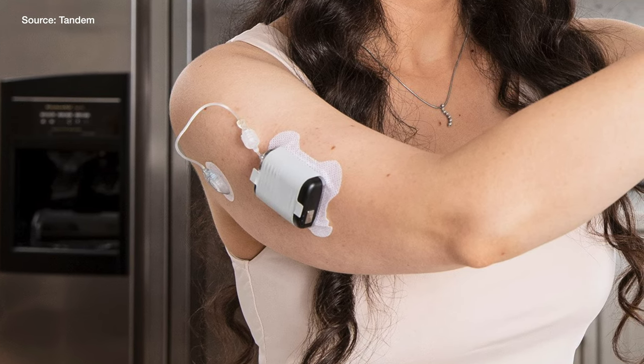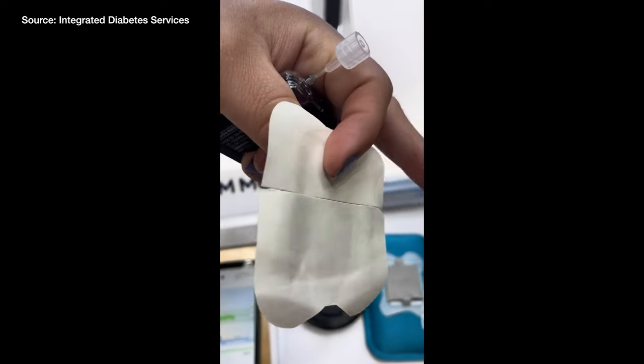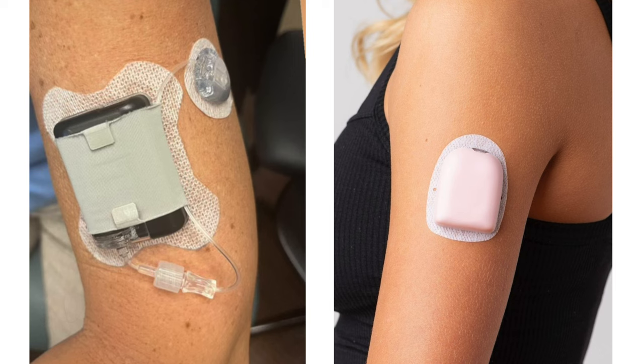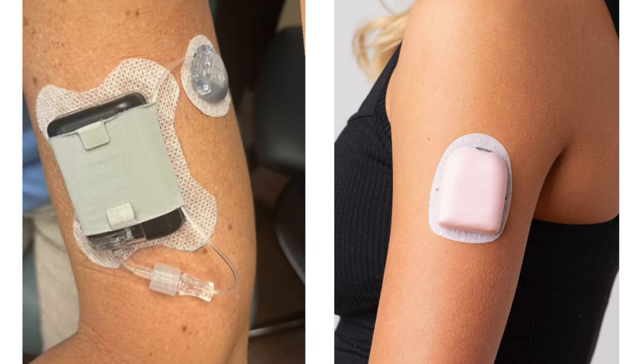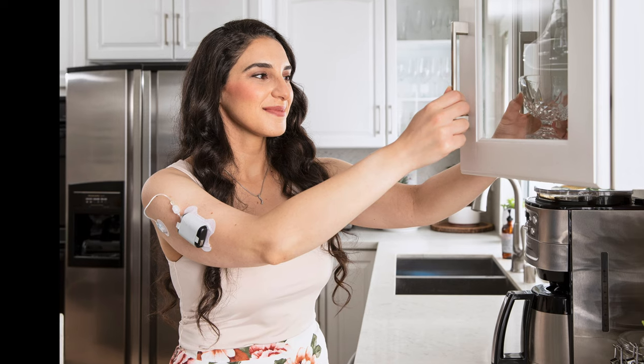The last way it can be worn is by being adhered directly to the body, kind of like an Omnipod. It gets placed using an adhesive and a pouch specifically made for Mobi. A user sent me a photo showing the Mobi adhered to a body — and honestly it's not cute, especially compared side by side with an Omnipod. It looks extremely medical and unappealing; it's not something I'd want to wear on my arm. I'm sure there are active use cases for it, but I don't know how many people will opt for this wearing method.